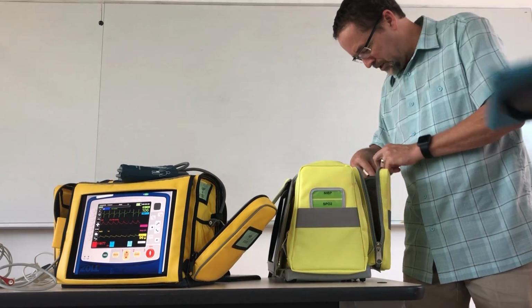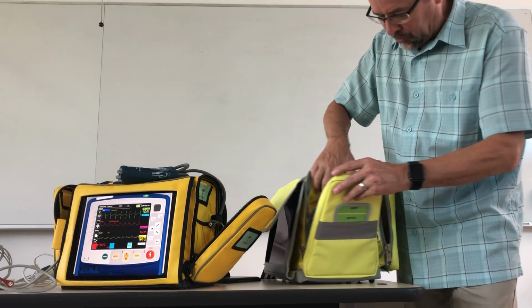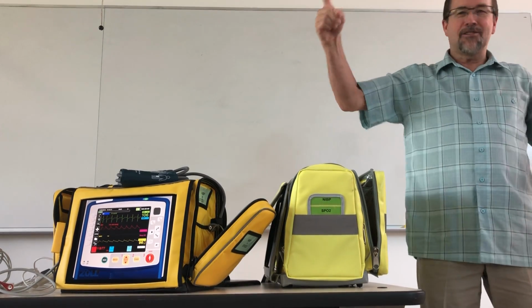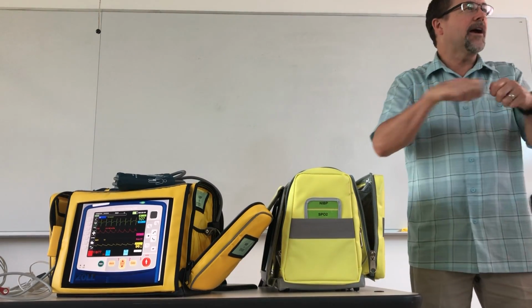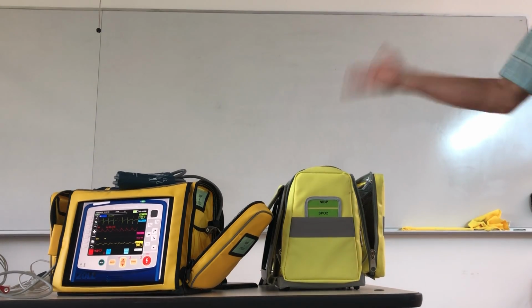I'm missing the cables. So normally I have just one of the generic cables. The problem is if you use the defib pads, when you take them out of the package, you've got to have something to plug into. So you need to have that little extension piece for them to plug into, even if the end of it's just tied to the bag. But then they end up kind of fumbling around in the bag to find the end of it to plug into, which you can see I obviously didn't tie it in well because it's gone.